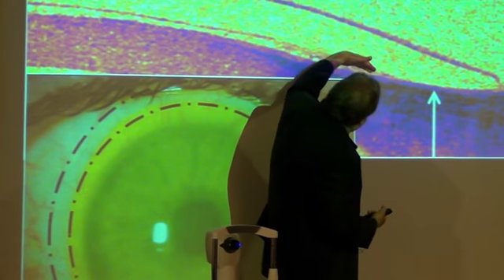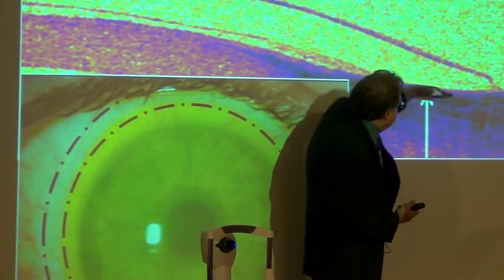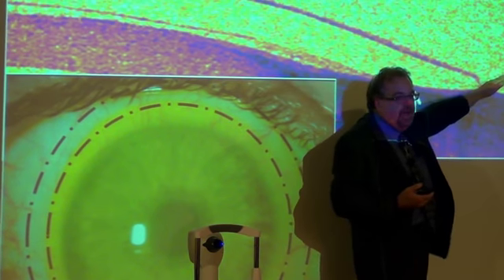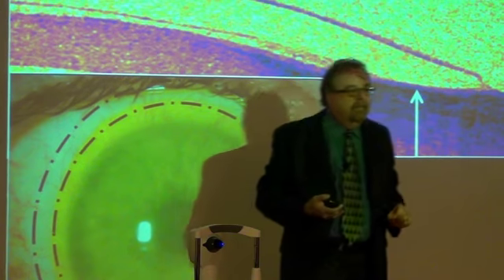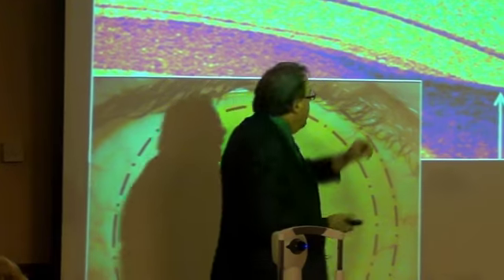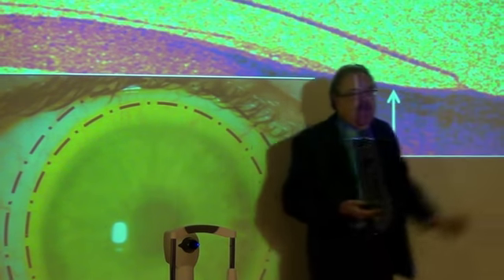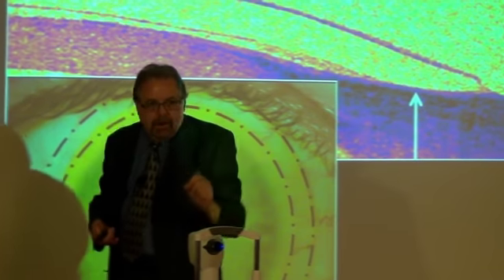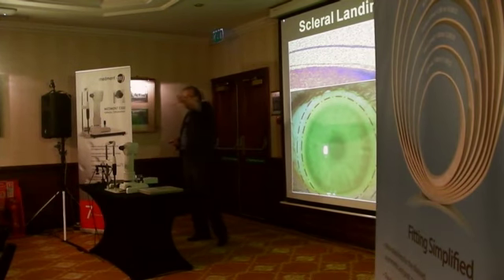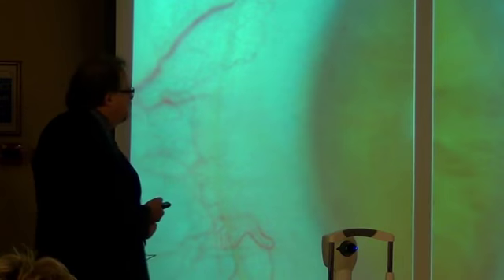What is the optimum contour to take that tangent angle and bring it into this area where it can once again depart the surface of the eye? So what you need here is what we refer to as a concave radius. A concave radius comes down and then up. And that's exactly what you need on the sclera. If it's convex, it's going to move in towards the cornea, no matter how flat that radius is. So we need that concaved area out there.